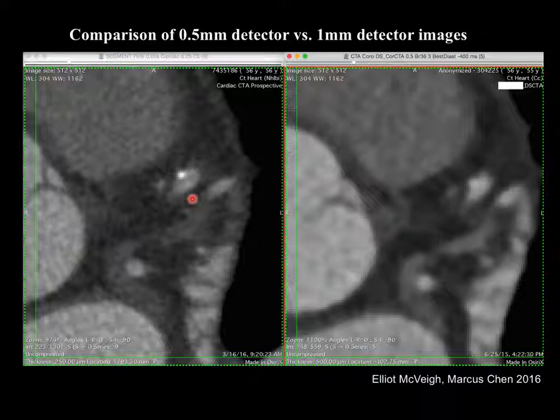So, yeah. In your experience, how much more often would you change how you would treat a patient based off of the higher resolution image? That's a fantastic question. The question is, I just want to get it on recording here, you have these prettier pictures or higher resolution pictures. How often do you believe it will actually change the management of the patient? And that's the critical issue.